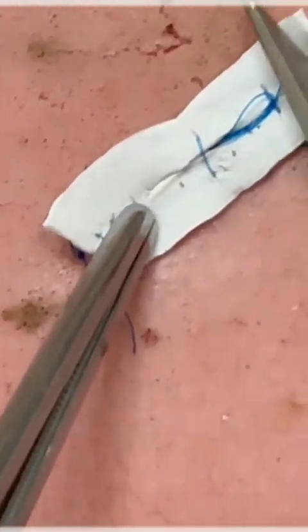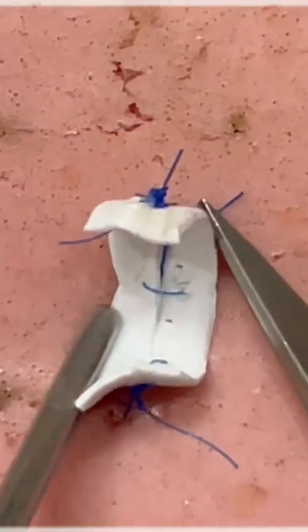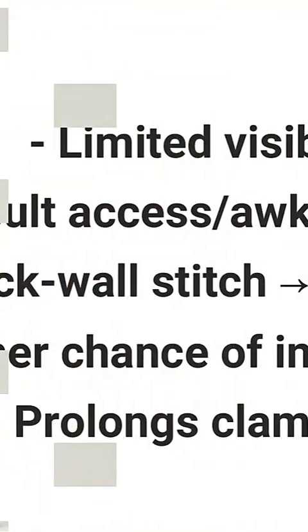The spacing is wide because I have not taken all the sutures. Basically, this is a demo video. In real life, you will take sutures at closer spacing.